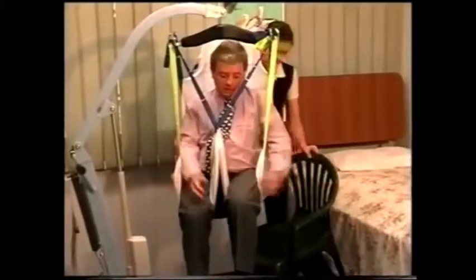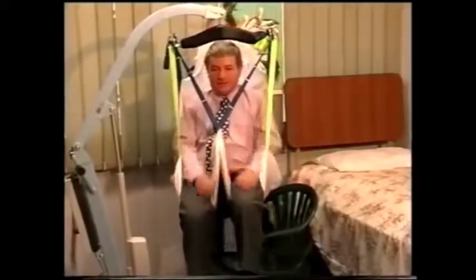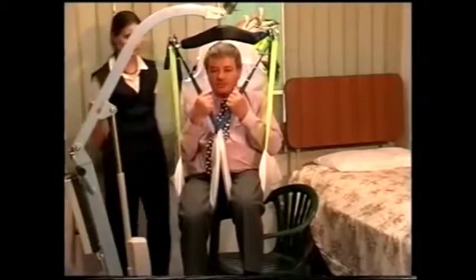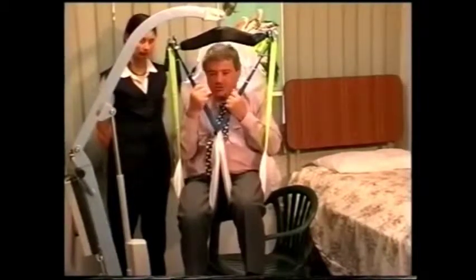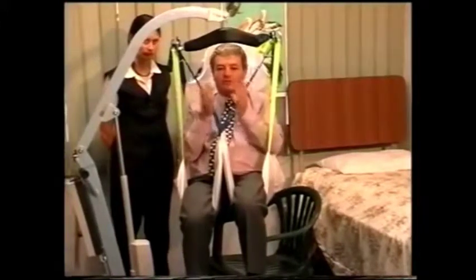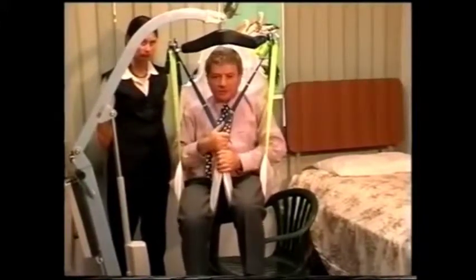But they're not going to splay open by themselves. If you have a hemi, they could have their arms inside. Another patient might like to hold on to the straps. But the fact that I'm sitting pretty upright, I can see what's going on. You've got the straps crossed over in front of you. You feel you're not going to fall out of it.